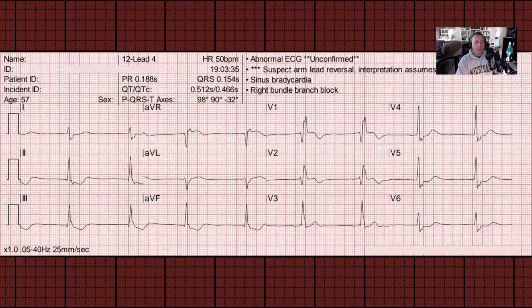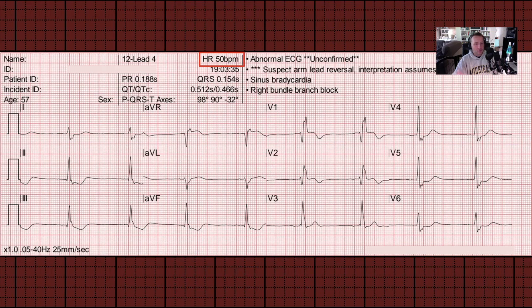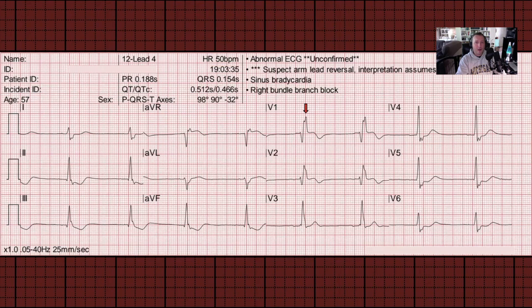Let's get started with an EKG showing a heart rate of 50. In the large block method with a regular rhythm, if the heart rate is 50, there should be six large blocks in between R waves. Looking at this ECG, we find an R wave that lines up as close to perfectly as possible with a large block line. I picked this one in lead V1, because that notch in the R wave lines up pretty well. Starting here and counting: one, two, three, four, five, six large blocks in between these R waves, proving that the computer is correctly analyzing this heart rate at 50 beats per minute.